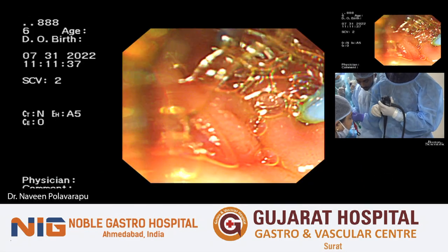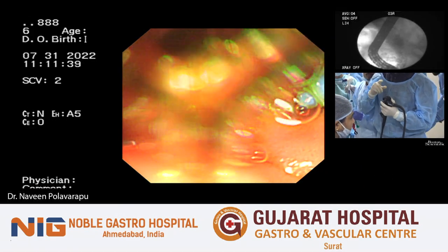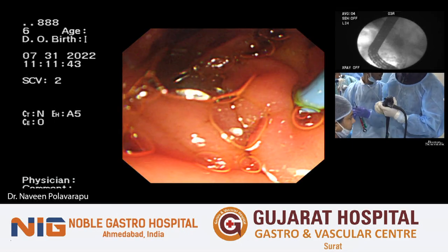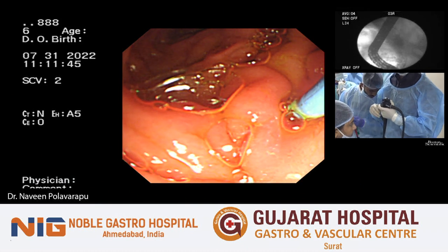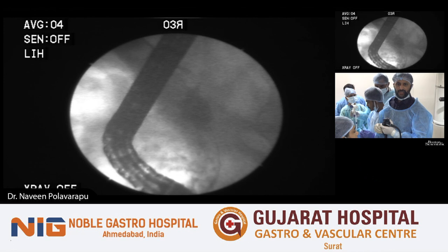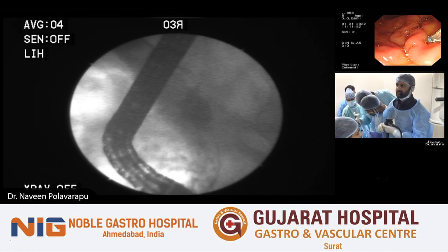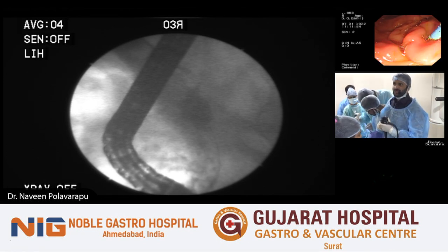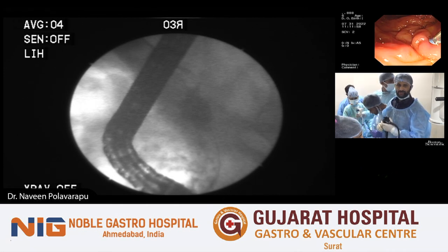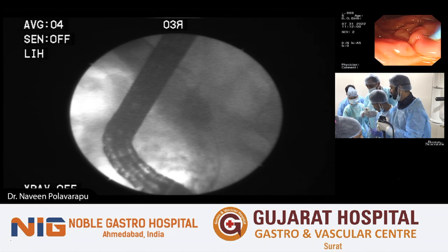Yeah, I would prefer having better cholangiograms, but I think you can appreciate, just about the scope, there is one filling defect, which looks like it's a square shape. The duct is probably about 15 millimeters, looking at the size of the scope, so the stone is probably about 12 millimeters. So we'll exchange to the spy scope now, over the wire, and then we'll visualize the duct and try to break the stone.